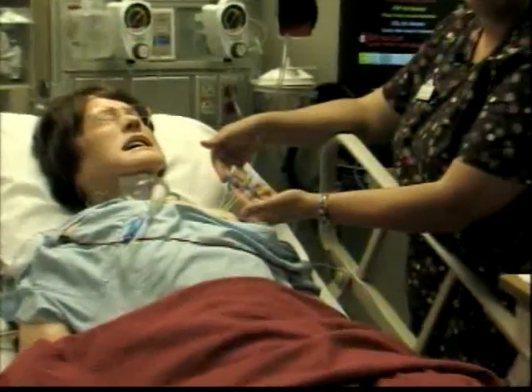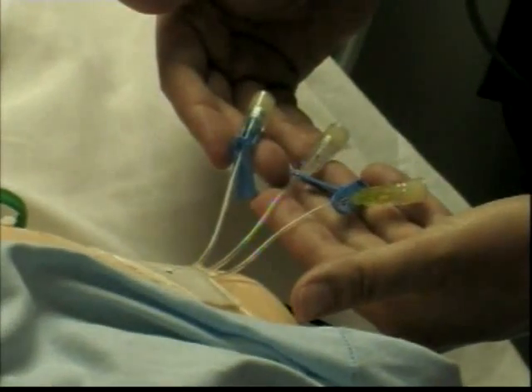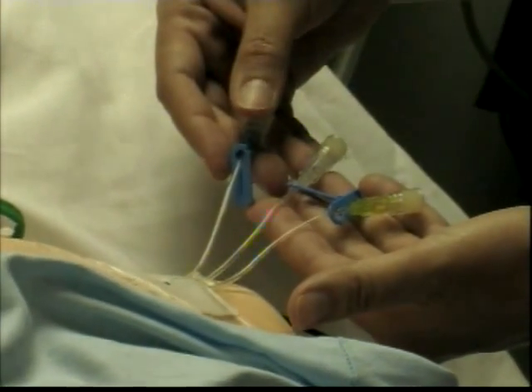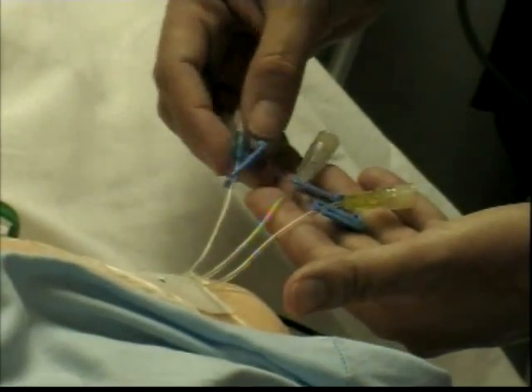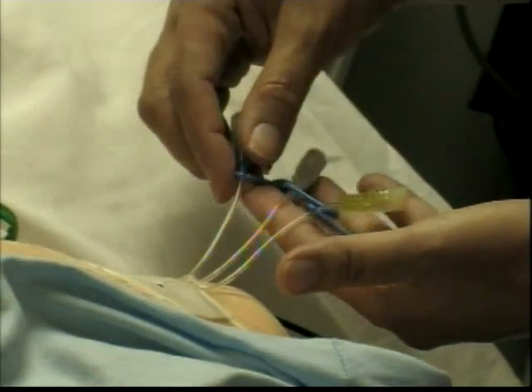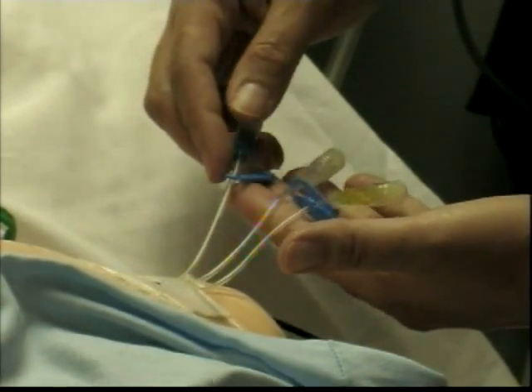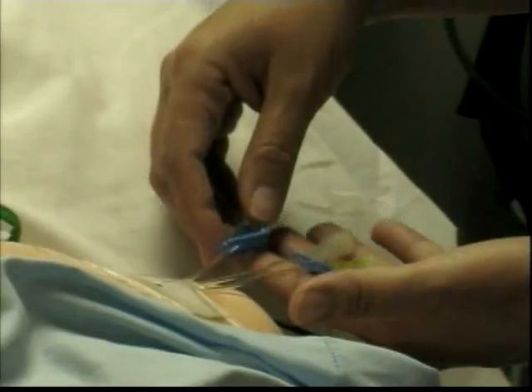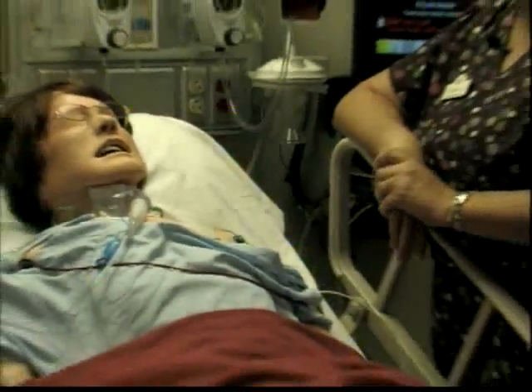So it has 3 ports that you can use to administer medications or fluids. So it has a distal port, a medial port, and a proximal port. And that will be important for you to know in regards to administration of medications and things that are compatible or not. But we're not going into all those details. I'm just going to show you how to actually clean it and change the dressing.